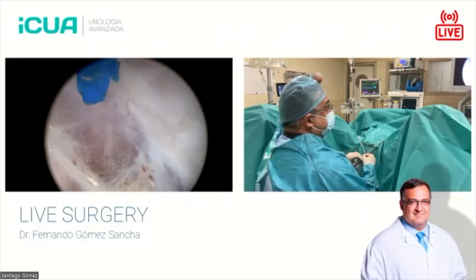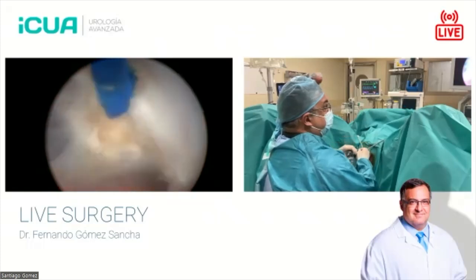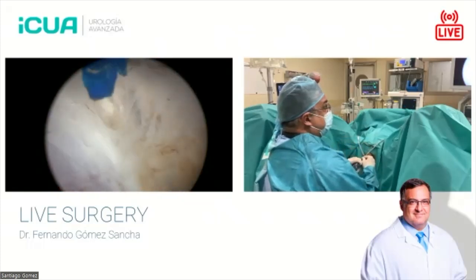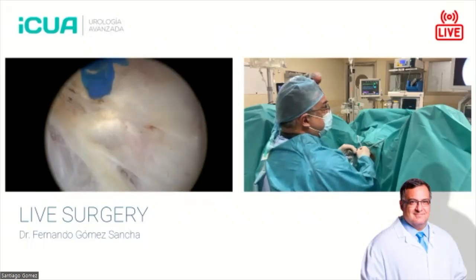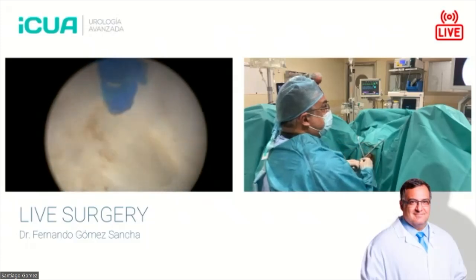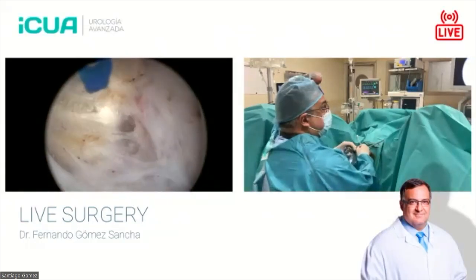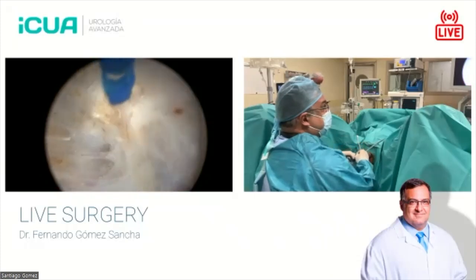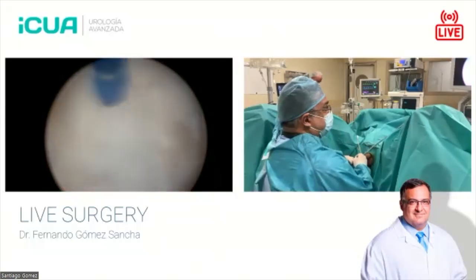You see, this is a little bit deep. It's not outside, but I'm going to keep the fiber up here. This way I can correct the plane. I can make sure that I don't go deeper than that. So this is how you can conduct a HoLEP quite safely, by understanding the laser tissue effects. Here, again, it's a little bit on the deep side, so I will keep close to the adenoma, trying to release everything.